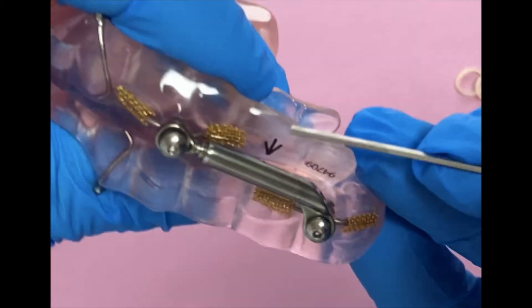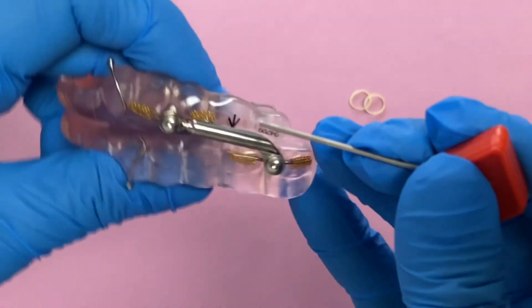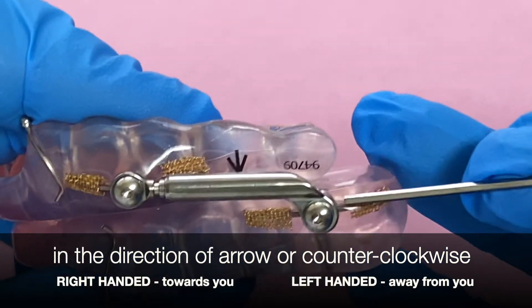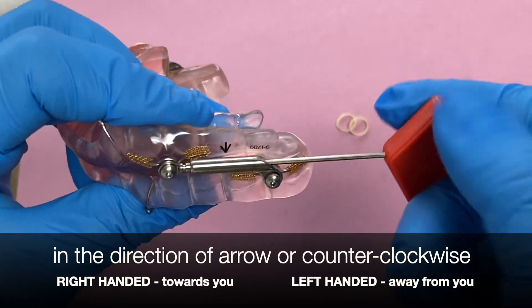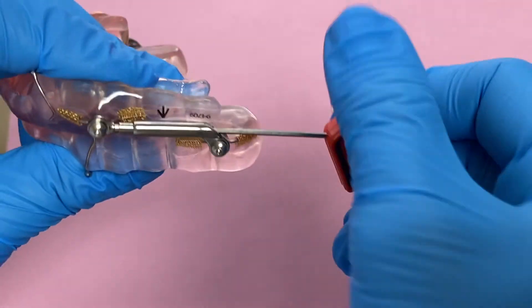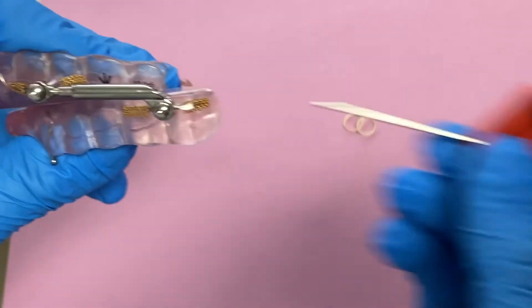I do that so later on when you make turns it's easier to see a full revolution or a half revolution. So now it's time to advance the device. To advance it, you're going to insert the reddish tool into the back end of the tube. Some devices might have an arrow embedded and some not, but the point is to turn in the direction of the arrow, or counterclockwise, or towards yourself. That's one full revolution, two full revolutions, and then one more half, and then take it out.